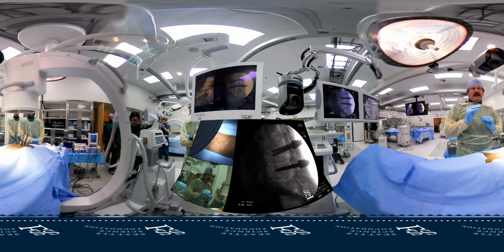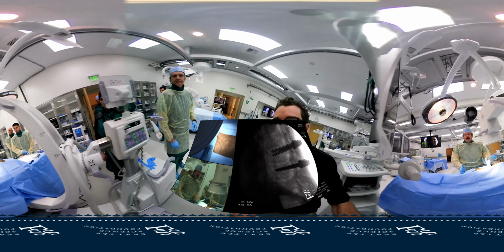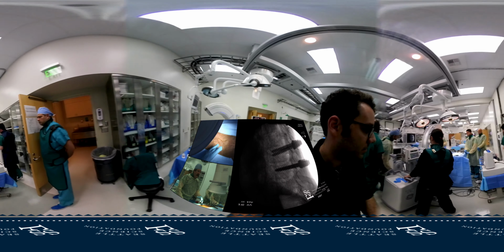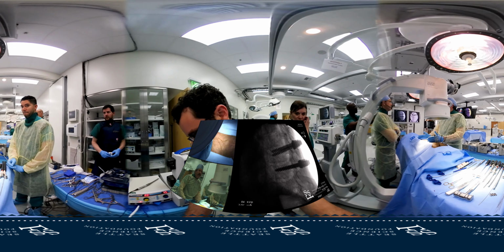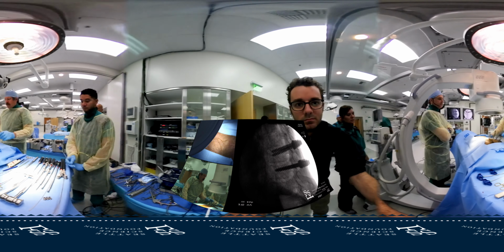Typically what I'll do is I'll put a set of screws right next to the fracture, then I'll skip a level or 2 and put another set of screws. And so really what I want is to have long lever arms. And in orthopedics, an external fixer becomes stronger if we put the screws near the fracture and then far away. And so basically that's what we're going to do. We're just going to create a long construct.